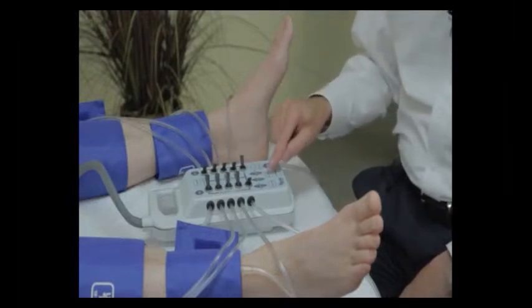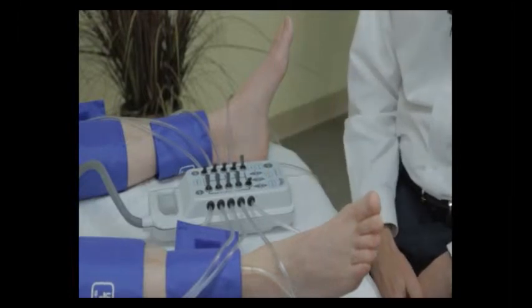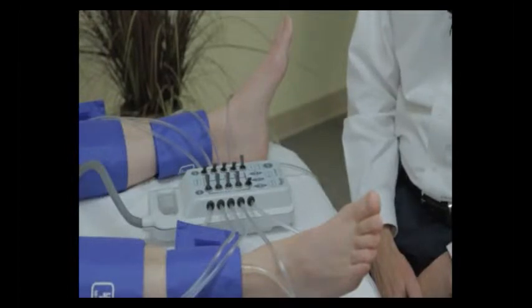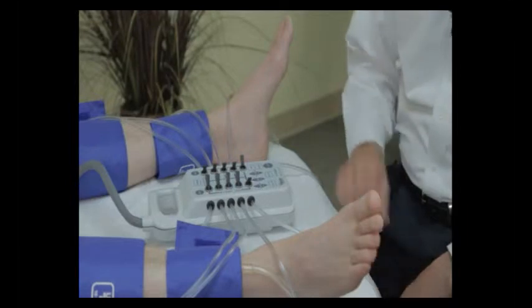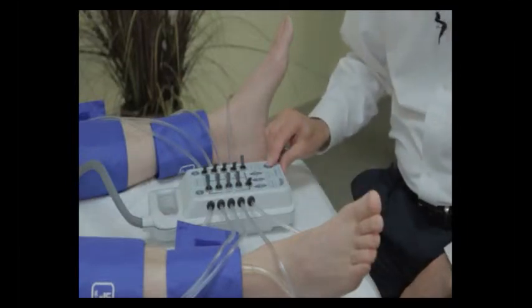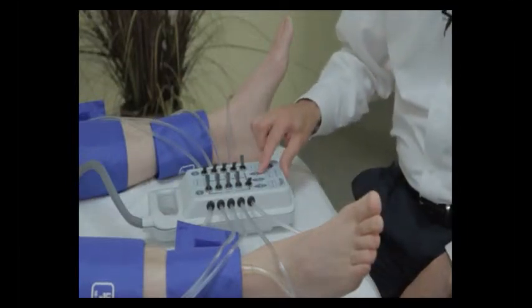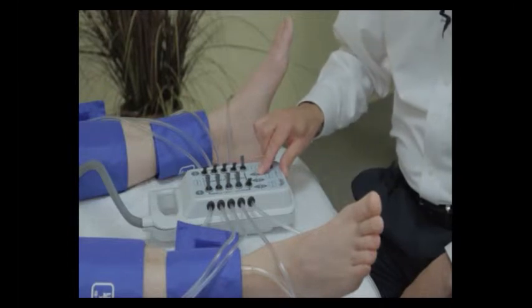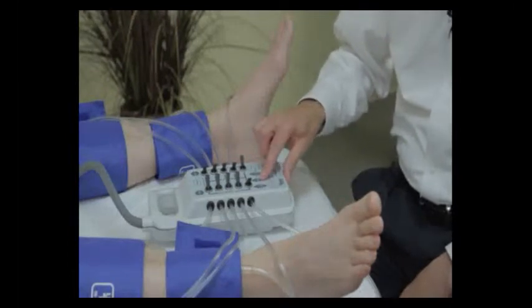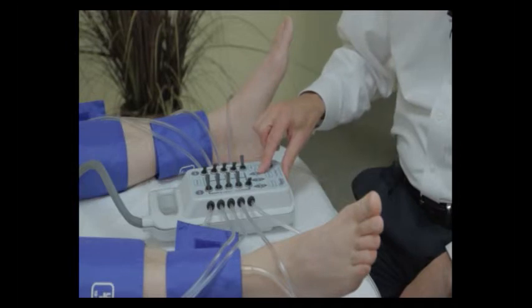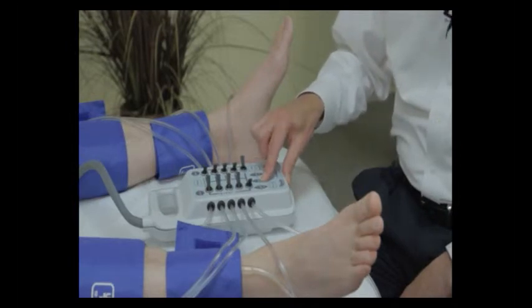I'm going to inflate the cuffs now by simply pressing the inflate button. Once my PVR waveform steadies, I'm going to capture it, and then I'm going to scroll it on my screen by using my baseline down and my gain down. Baseline down is slow scroll, gain down is fast scroll.